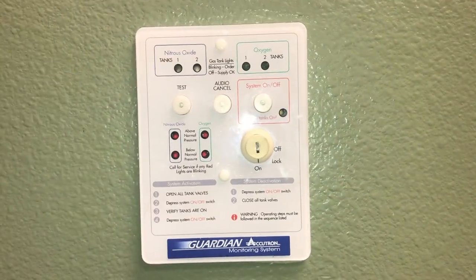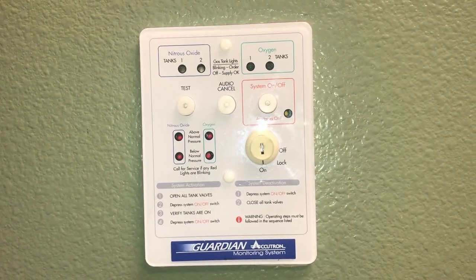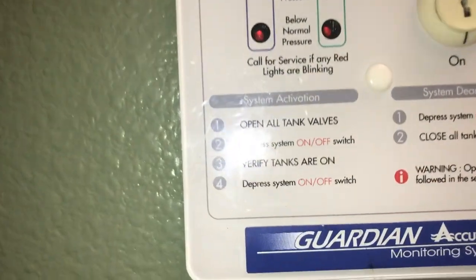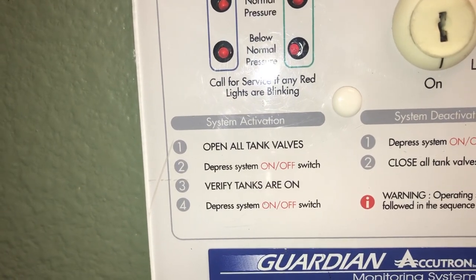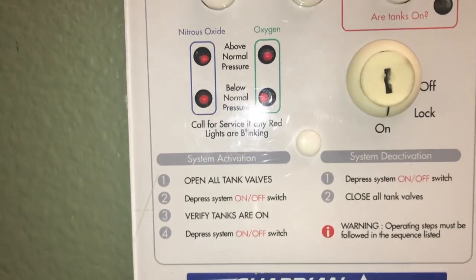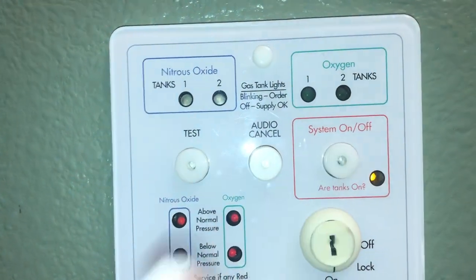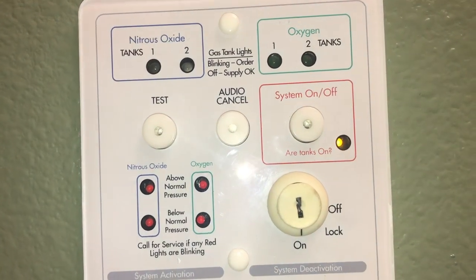This would be the main panel where you are going to turn the system on. You can see that there are many lights, an off/on button, and instructions. If you come down to the lower area, you will be able to see the instructions for turning on. You have already seen the video about opening the valves. We are then going to press the system button to turn that on. What you are going to see is a yellow blinking light.